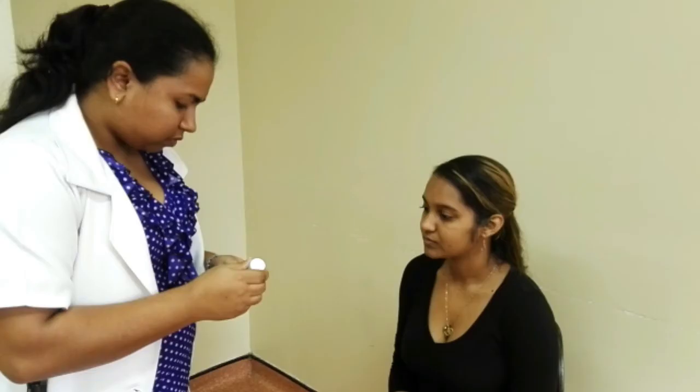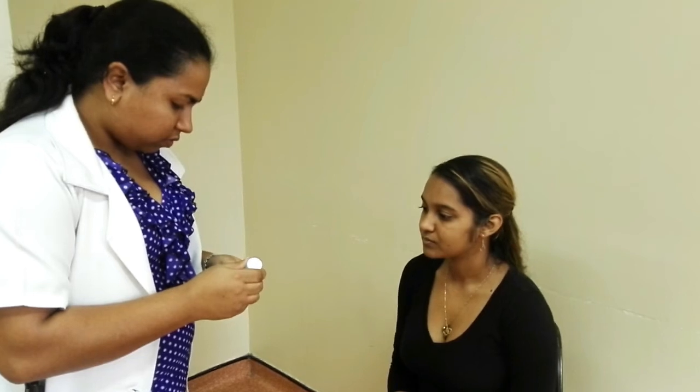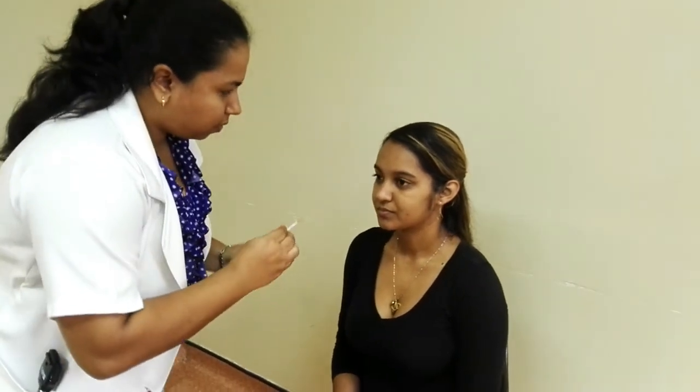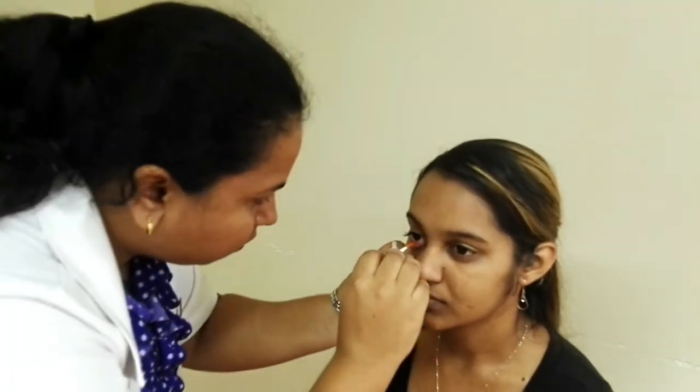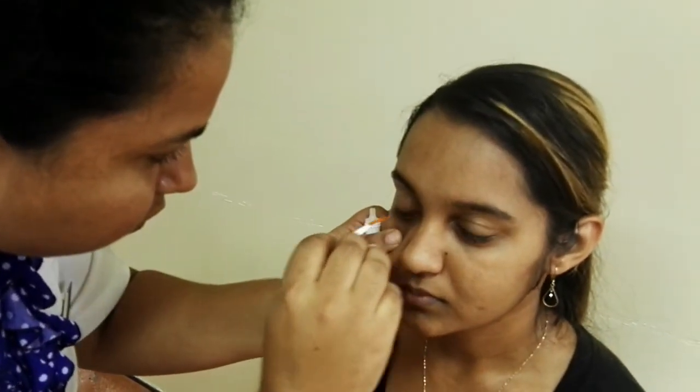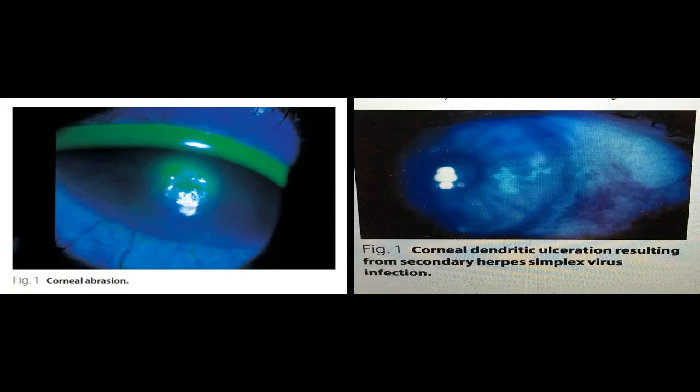Lightly wet a dye strip with an eyedrop — in this case, alcaine is being used. The patient can be warned that it may cause blurry vision afterwards. Gently dab the strip onto the conjunctiva of the lower lid and have the patient blink to spread the dye out over the cornea. The lights are dimmed and the cornea is examined under the cobalt blue filter of the direct ophthalmoscope. Identifiable pathology includes corneal scars and dendritic ulcers.